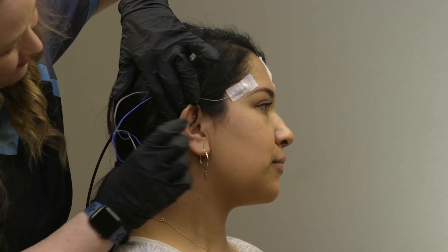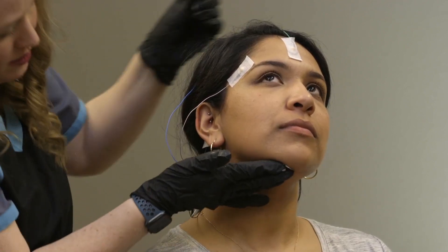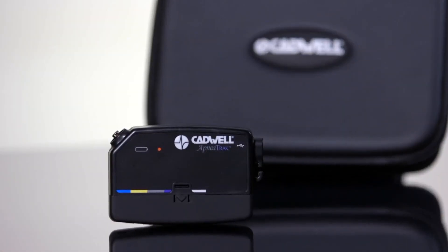Keep the electrodes in the locations they were placed. If any electrodes pull off, you can often push them back into place, or call your medical provider for further instructions. If your provider gave you specific instructions, follow those instructions first.